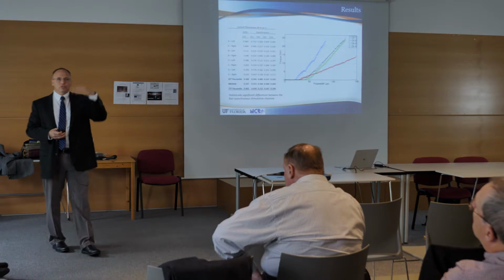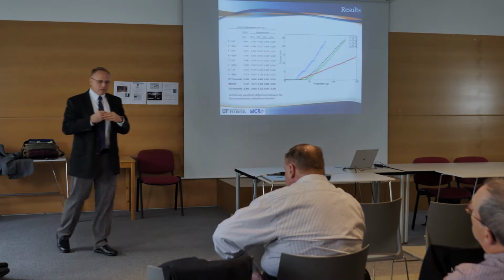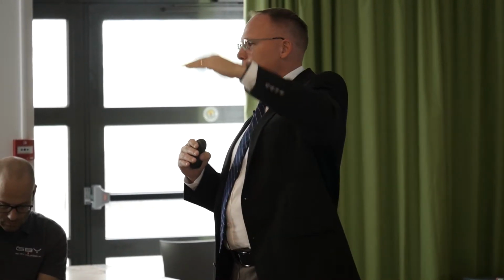And so there's two effects there. One is that the asynchronous stimulation helped with the fatigue, but it also helped with the overall force. That's correct. Yeah, I was able to produce larger force for a longer period of time. It's a fatigue issue in the sense that I'm able to maintain a certain level of force for a longer period of time. So it's related to the fatigue. It's the fact that it's less fatigue, you can maintain that. Okay, I didn't see that, because it did start off in the exact same spot.